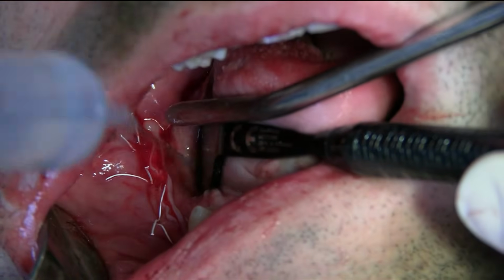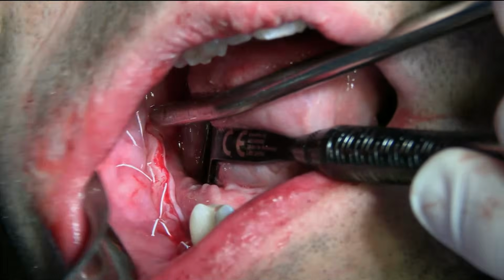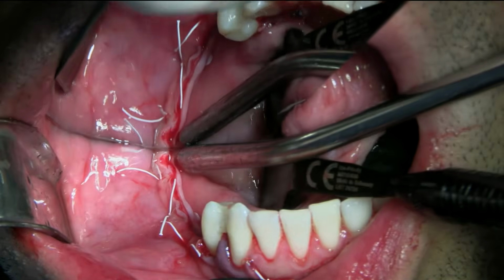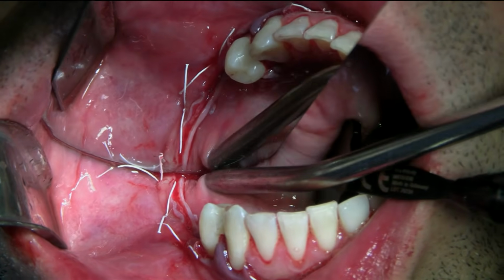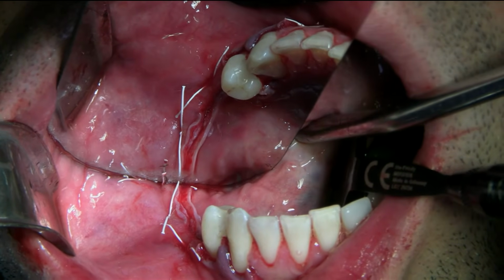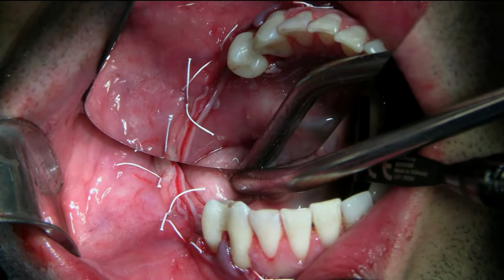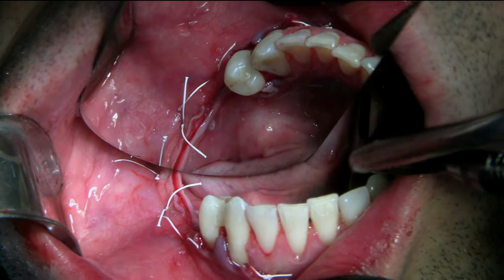Okay. Water. It's hard to believe how much tissue we got coronal, but you can see my mattress sutures are probably 4 or 5 millimeters below the incision margin. So now it's still not sealed completely, because we need the single interrupted sutures, and I'll finish with that.